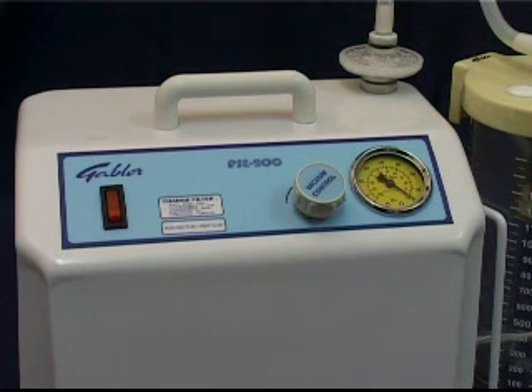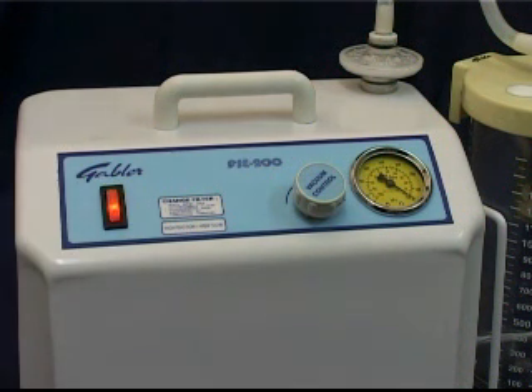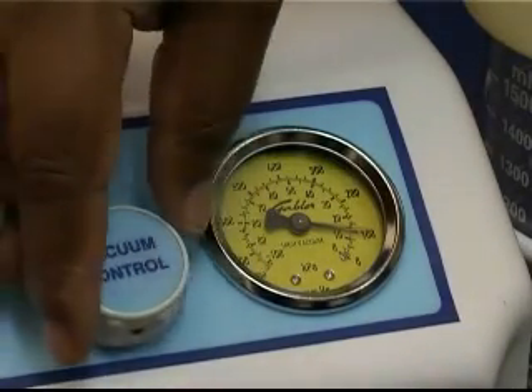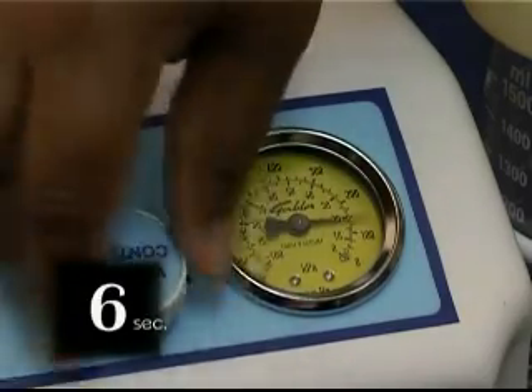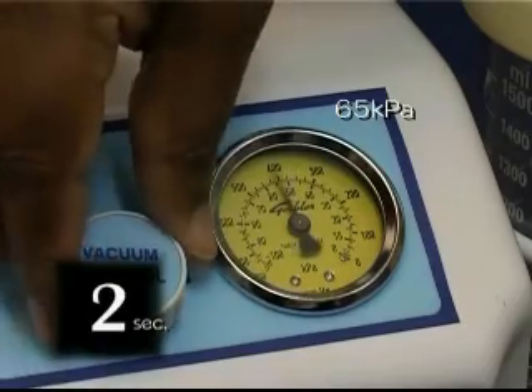First, turn the vacuum control knob to maximum and then switch on the unit. Note the indicated vacuum on the vacuum gauge. Now, block the suction inlet of the collection jar. An increase of 65 kPa should be reached within a short time, typically between 6 to 10 seconds.